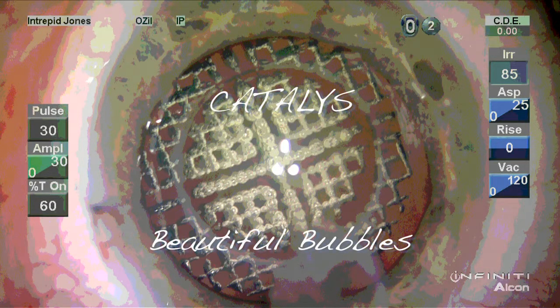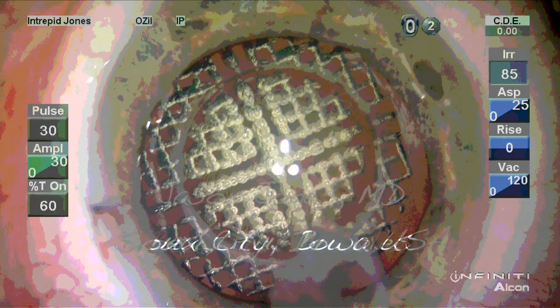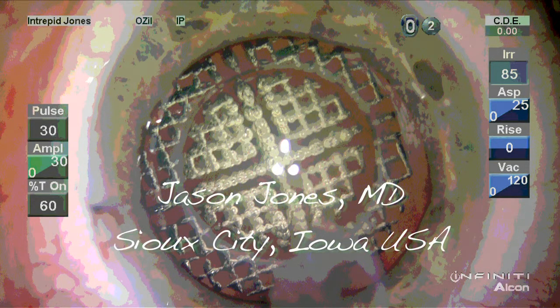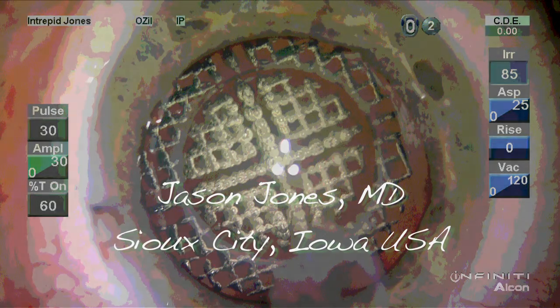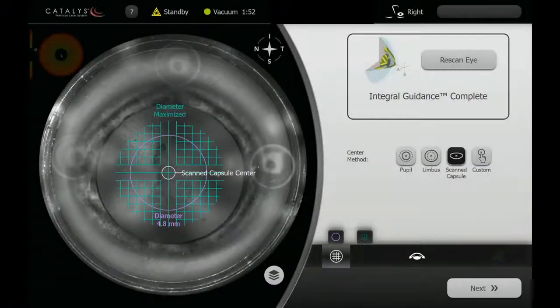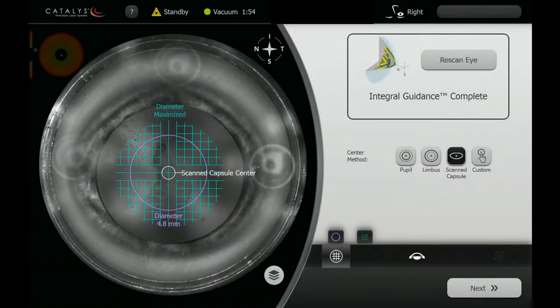In this video, I'd like to share with you the experience of treating a 37-year-old man with a PSC cataract.